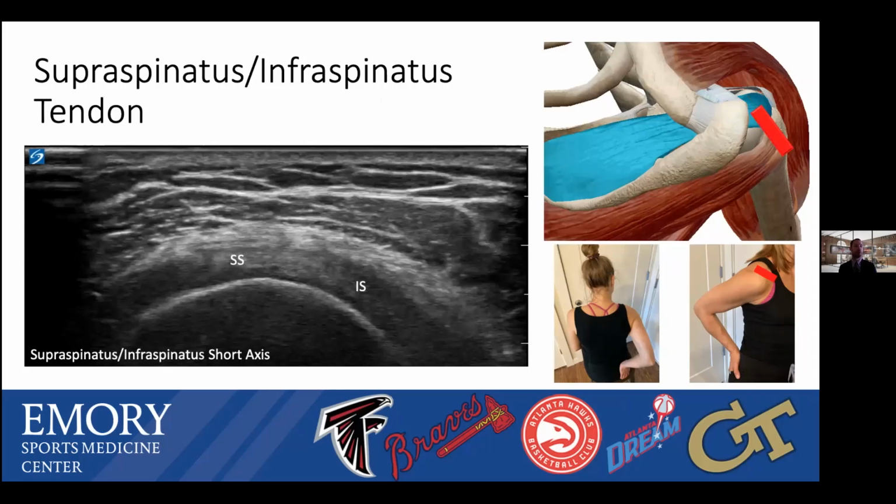And I'll slide posteriorly to get that infraspinatus within that short axis view, and just bringing the full extent of the tendon in. And you can slide more laterally to make sure you're on that middle facet for the infraspinatus to take a look at that. I'm looking for a tearing of the tendon.